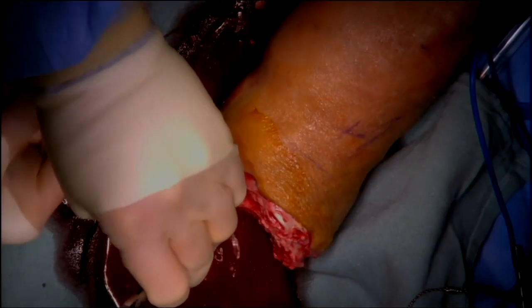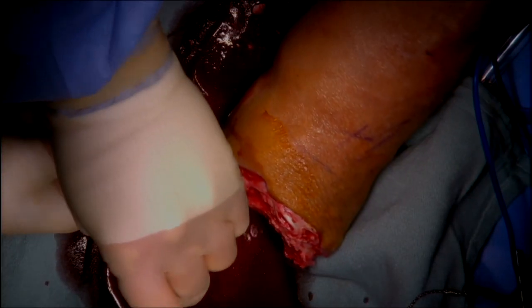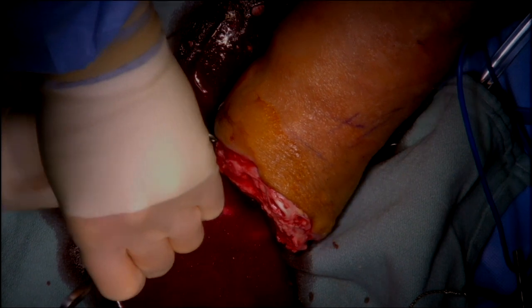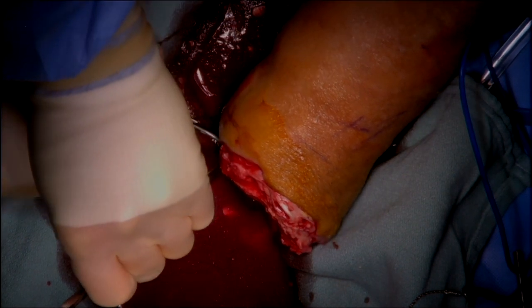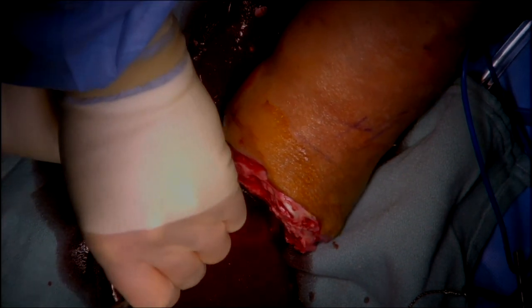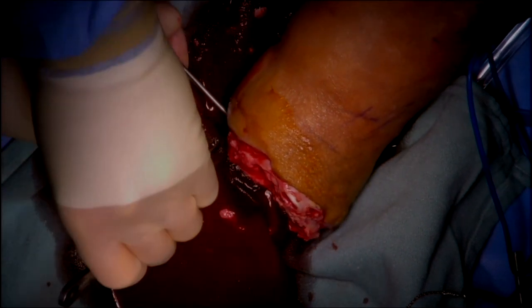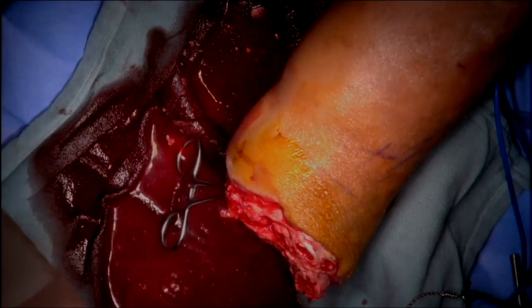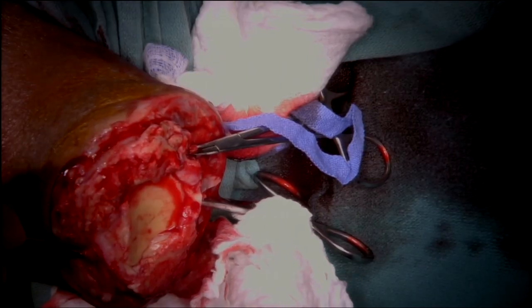Once the transection is completed, the exposed vessels are then identified, and vascular control of the exposed tibial vessels is then obtained using a hemostat, as noted in this portion of the video.